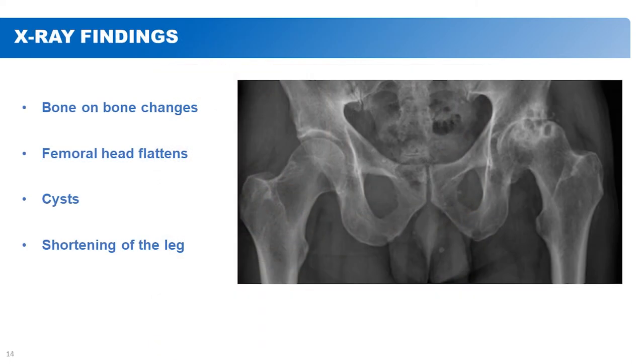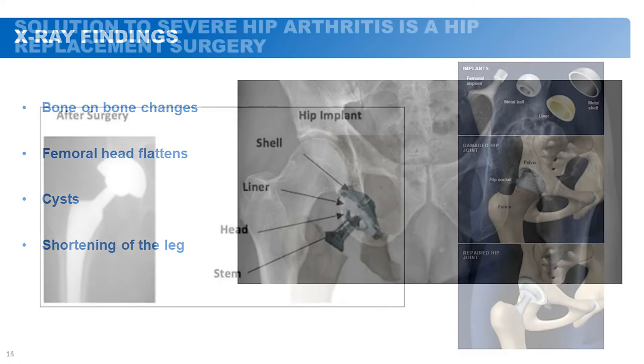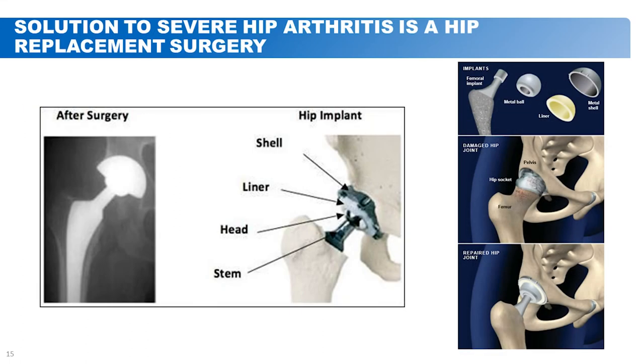What do you see on the x-ray? Well, for a typical patient with osteoarthritis, you're going to start seeing bone-on-bone changes. On the right, you'll see the cysts that have formed over the femoral head. The leg is shorter visibly on that side. It doesn't look like a round ball. Like if you'll notice on the left side, it looks round. You can see the socket. On the right, the ball is now flattened. It almost looks like a football instead of a baseball. And you can notice that the joint is starting to slip out of place. Those are the type of x-ray findings you'll see in an advanced patient with hip arthritis. The solution to this is a hip replacement surgery.